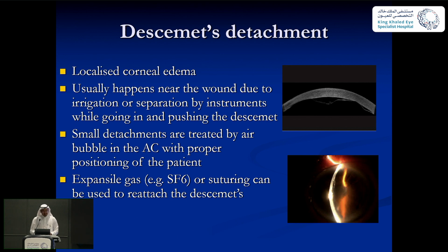And if the detachment is noticed to be large and it would take time, we can use expansile gas like SF6, or even suturing has been reported to reattach the DSM.